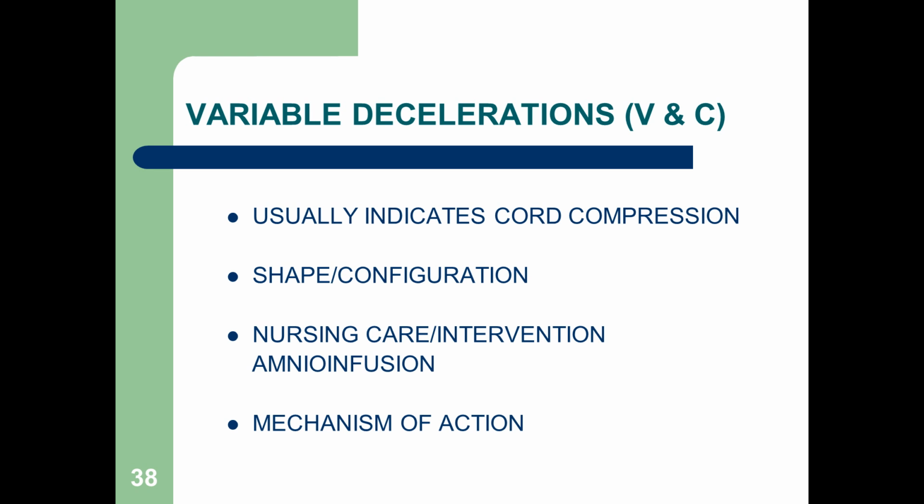You have to monitor very, very carefully, though, if this is what's ordered. You've got to monitor the patient's temperature, especially because there's a risk for infection when we administer an amnio infusion, okay? So monitor their vital signs, the mom's temp. Certainly you're continuing to monitor the baby's pattern.